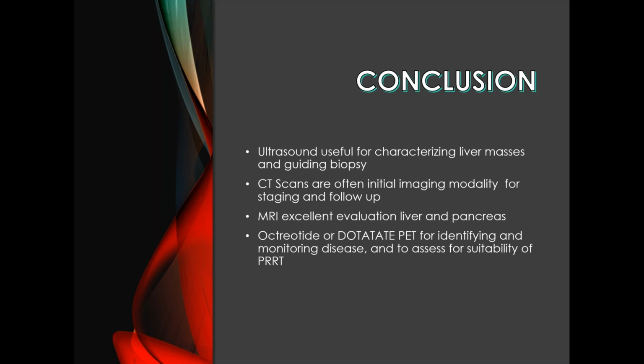Commonly used for neuroendocrine tumors of the liver? So Primovist is great for finding lesions such as FNH, so other lesions. It can be helpful for basically making sure it's not a benign liver lesion, which can sometimes be an issue. So the radiologist definitely has the ability to use that as well as gadolinium, and to pretty much put it all together and figure out whether or not they think it's a neuroendocrine tumor or another lesion. And so that's when they use Primovist versus gadolinium.